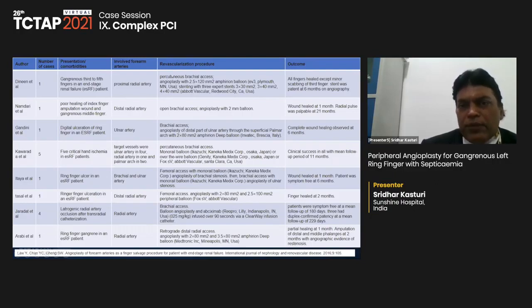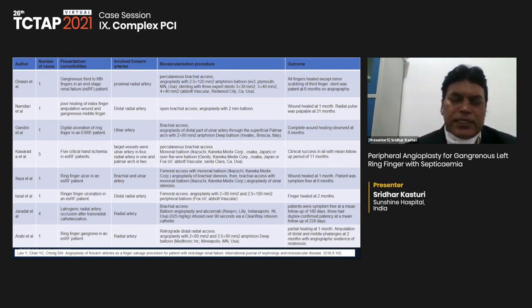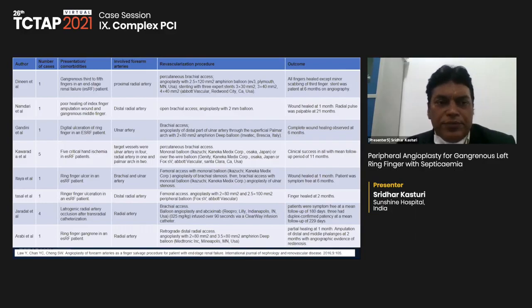This is the only case report I saw where stents were implanted, but it would be preferable to avoid the stents because of the superficial location and muscular compression; the stents can get distorted. Ideal to do the balloon dilatations. If needed, you can do the drug-eluting balloon also.